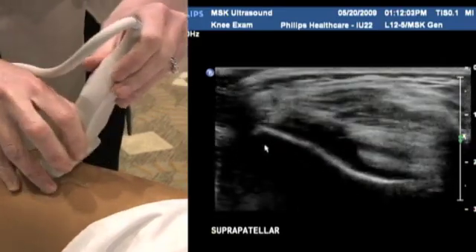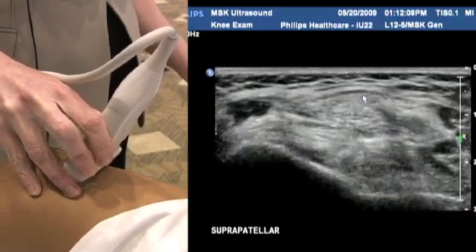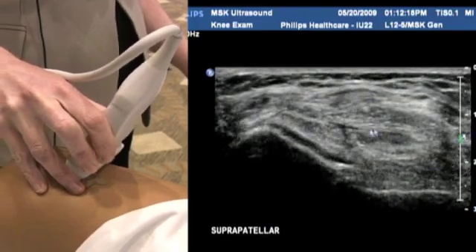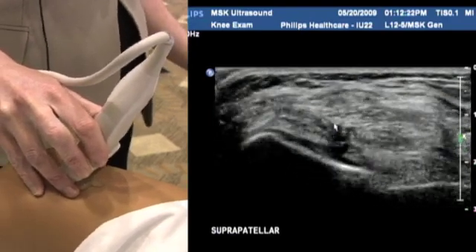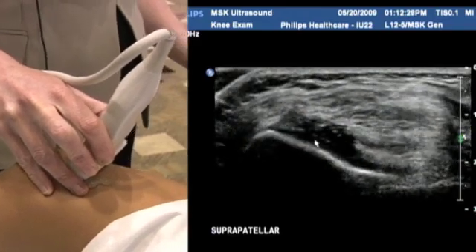If we go down to a transverse section now, watching the quadriceps tendon here, as I said, it's quite a wide tendon side to side, so that's why the Linear 12 is a good choice, because it's got such a wide face. You can see here this is the tendon in its entirety. Looks nice and homogeneous, it's quite an echogenic tendon. As we scan down towards the patella, again you come into this small amount of fluid here, again quite normal, so nothing to worry about.